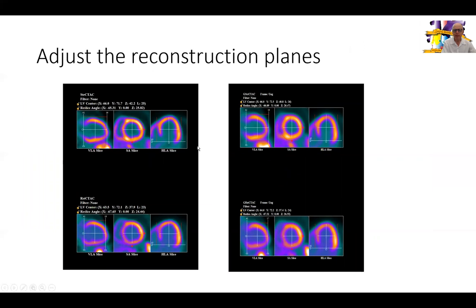The next step is to make sure we adjust the reconstruction planes, so that when we generate the perfusion images to analyze, we are properly positioned over the heart and all images are aligned. On the left you can see the perfusion static images, and on the right the gated images, all after alignment and selection of the area of interest with the selection circle around the heart.